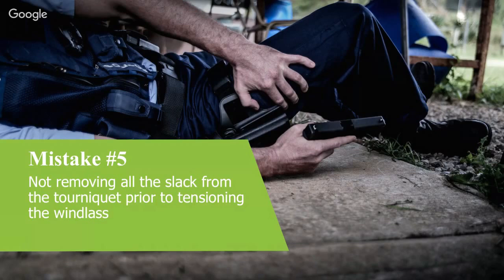So that's mistake 5, slack, and it is one of the most common mistakes we probably see: really wanting to start turning that windlass a little bit too early. Anything more on that one, Dan? No, I think you've pretty much covered it.